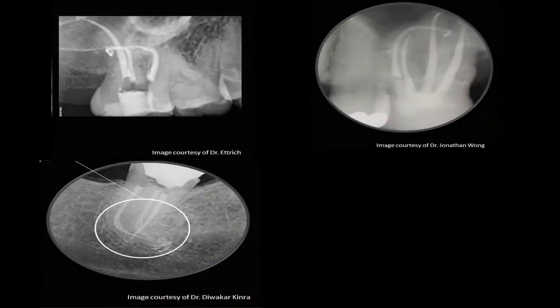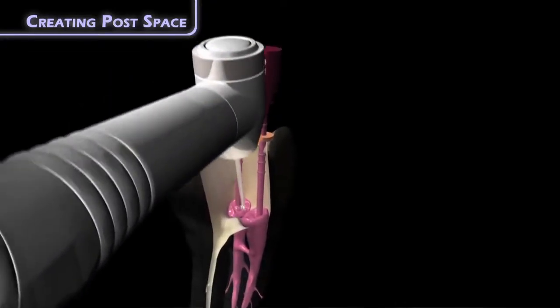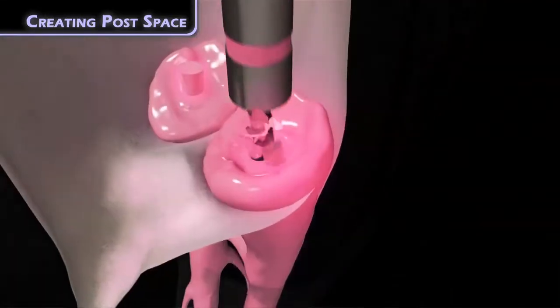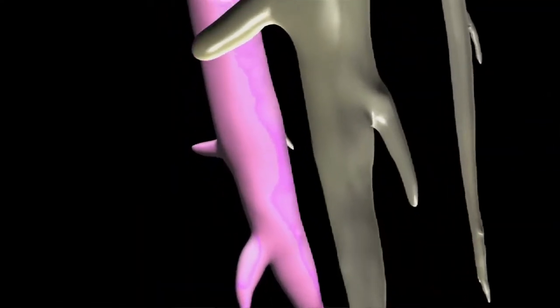As a recap, retreatment of gutta core is not an issue — if you can re-treat gutta percha filled canals, then you can re-treat gutta core. The same is not true for canals obturated with gutta percha and plastic carriers. The cases shown demonstrate how beautifully gutta core can obturate curved canals. Post-space preparation of gutta core obturations is as easy as with traditional gutta percha obturations, unlike other carrier-based systems with a plastic core, which do require special post-space kits. The beauty of this technique is in its simplicity and engineering, making gutta core the most predictable and efficient obturation system on the market.